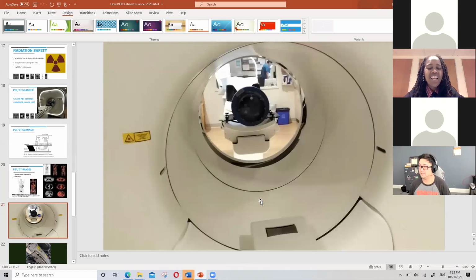The next couple of slides are basically an insider view into our camera. A lot of our patients have had all kinds of imaging: CTs, MRIs, ultrasounds, SPECT CT. So just know that our cameras tend to be more open than an MRI, and the tube tends to be shorter. So the full body isn't in our scanners, although there are some beautiful full body PET scanners under development that can image a body in less than 5 minutes. So for our claustrophobic patients, that's going to be a game changer, we think.